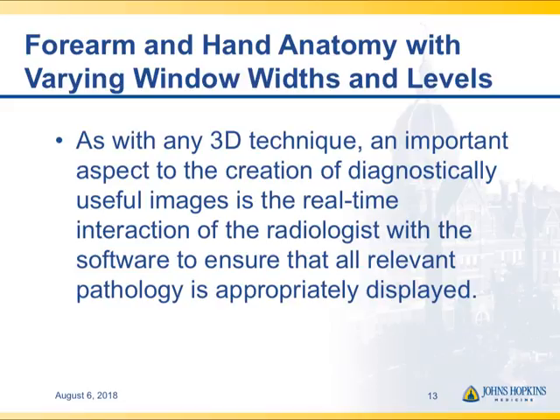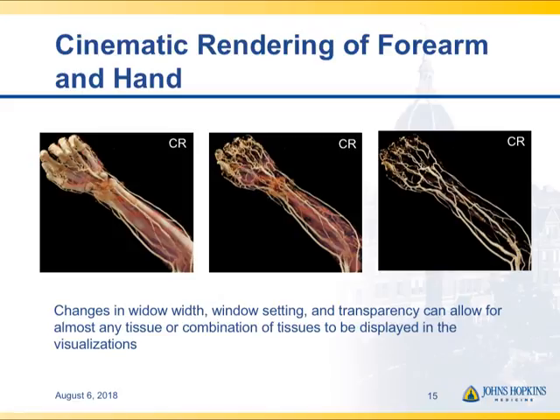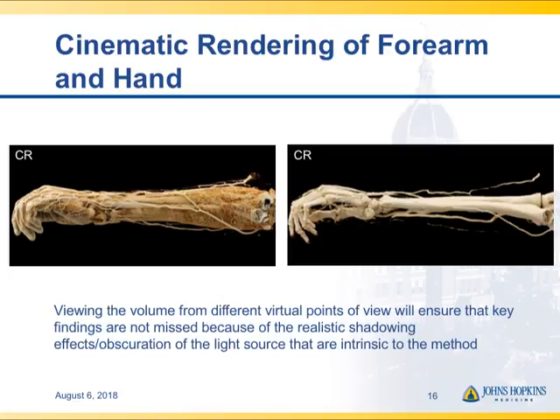Cinematic rendering is not plug and play — you need to do some work. We've developed presets which make that work a lot easier, but it still takes some experience and learning. Here is a good set of images going from muscle to transparency through muscle, optimizing vessels, and then showing bone. Like classic volume rendering, we're able to optimize — going from vessel and muscle to vessels with bone removed to vessels only. The ability to change the data set and optimize for the specific problem at hand is straightforward, nicely demonstrating the importance of the lighting model in showing bone, soft tissue, and vessels.